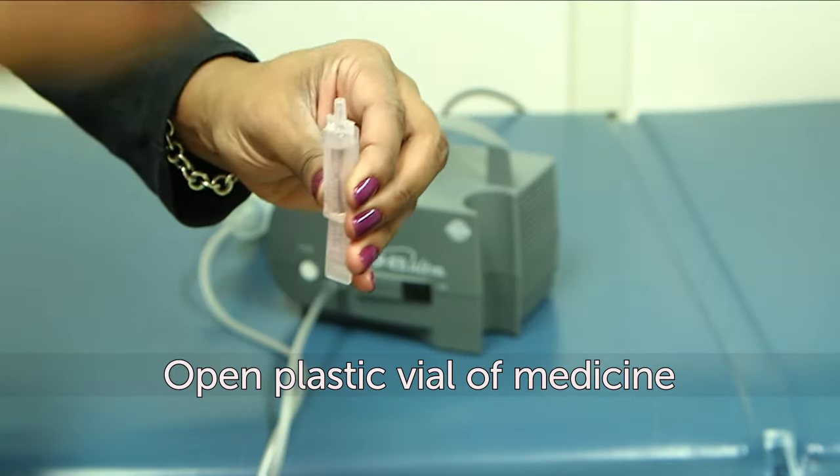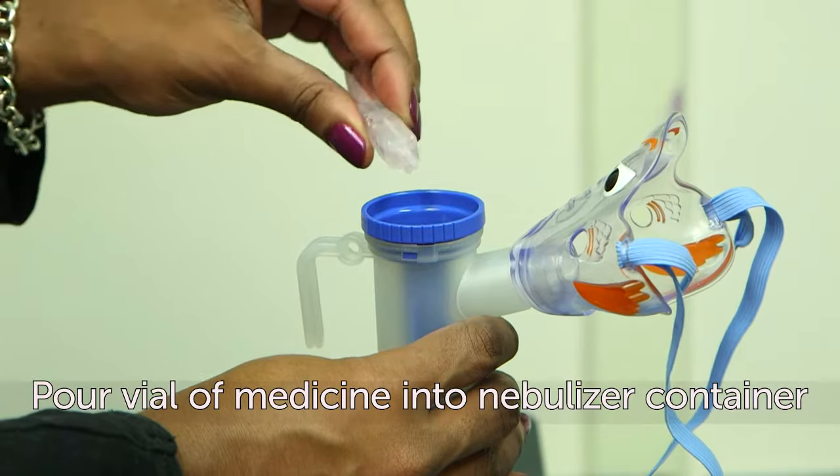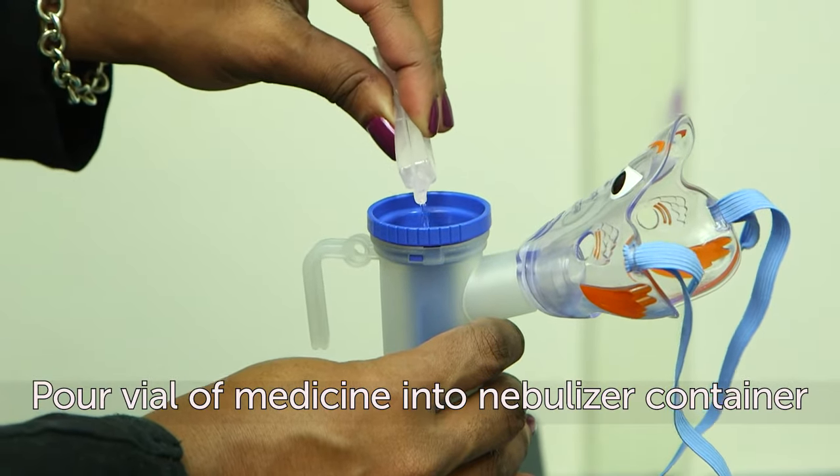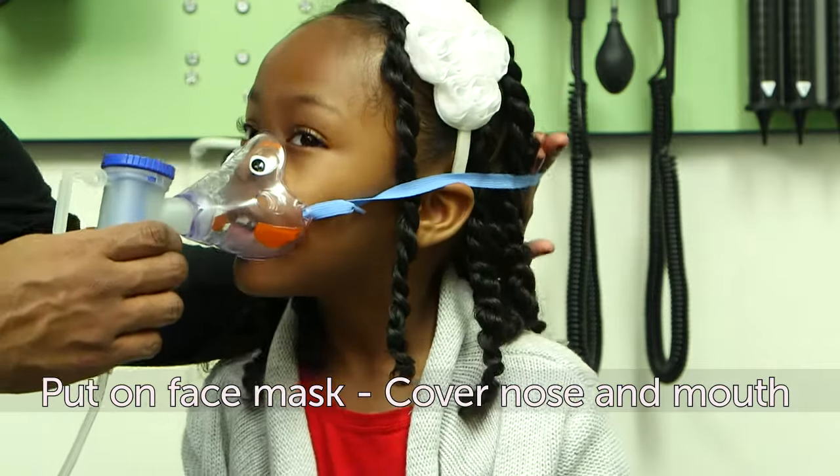Next, open the plastic vial of medicine and pour it into the nebulizer container. Now, put on the face mask so it covers the nose and mouth.